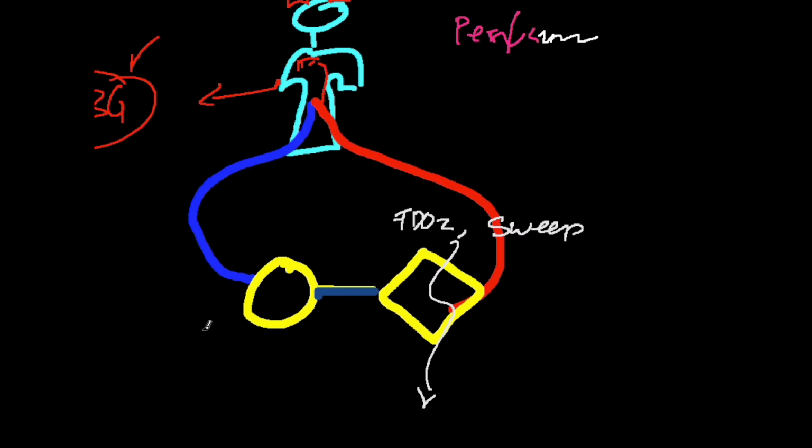One is what's known as P vein, and that's the pressure within this line, and it's always going to be negative. It's going to be something like negative 70 to 80, and certainly becomes problematic when it is more negative than negative 100. And that means basically that you're sucking pretty hard from your motor and you're not really yielding blood. You're encountering resistance at the other end of your cannula.